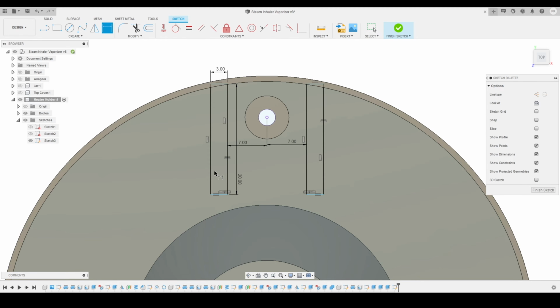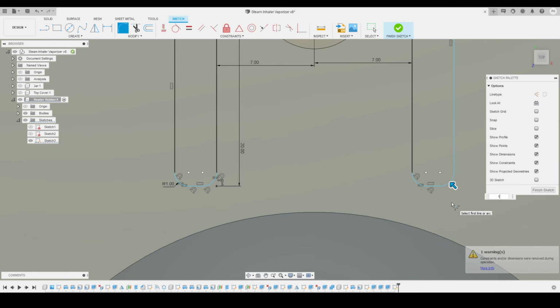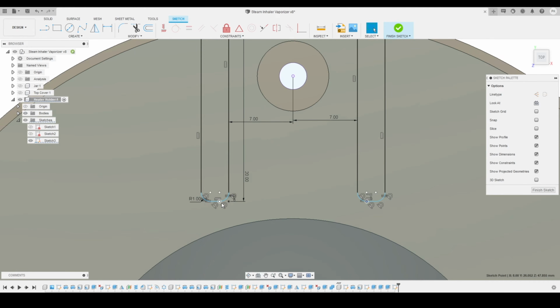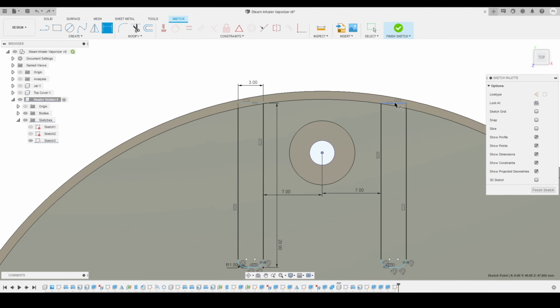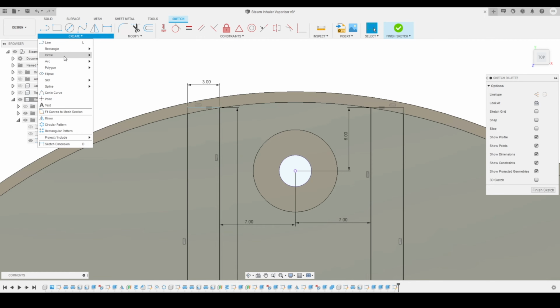Now I will apply a fillet of 1 millimeter on all these 4 corners. So you can see I'm just selecting the corners and applying the fillets of 1 millimeter. Because of applying the fillet, this line just got distorted. So I will apply the equal constraint again on both the sides, just by selecting the line and applying the constraint. Here you can see I will make sure that these 2 points are on the same horizontal position. So I had applied that constraint. Now I am able to move this complete horizontal rectangle towards bottom or upward. So we have to make sure that the top of the profiles are also in the same collinear position. So we'll apply the dimension from the center to the top. Here you can see I will just apply 6 millimeter, and now it got completely constrained. So now I will go on to the project tool.